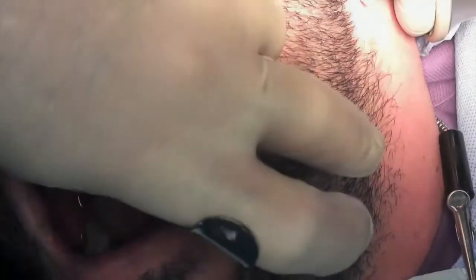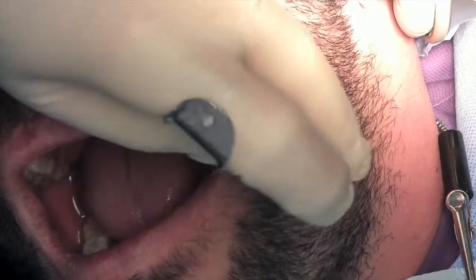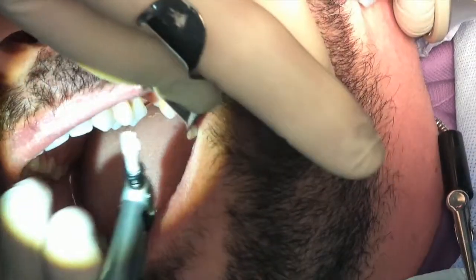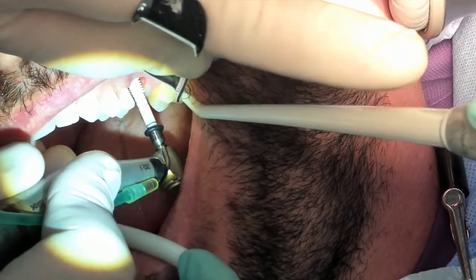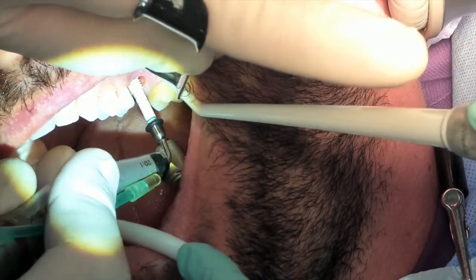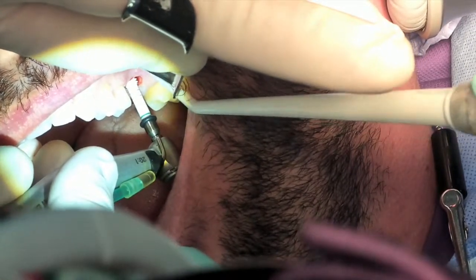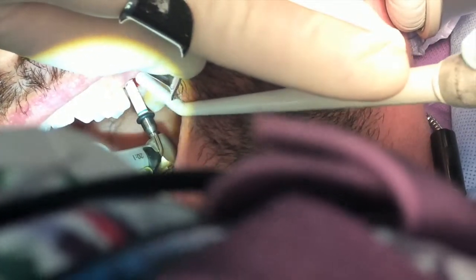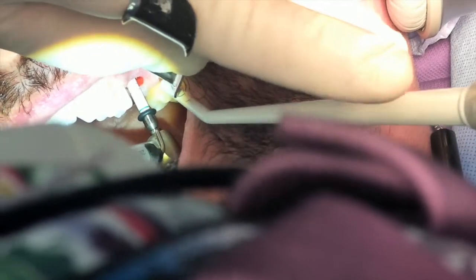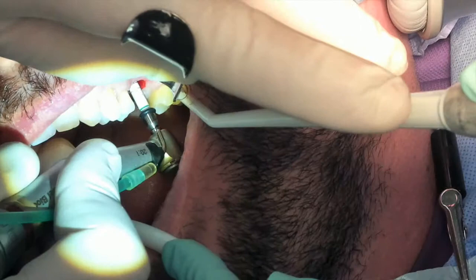I've pushed the bone up to 2 millimeters in the septum. But we are going to tap. So we're going to just come in here with our 5.0 self-tap. Ceramic drills are phenomenal. They stay case after case after case. So beautiful, so sharp, such a good cutting surface. And we're just going down to the 10 millimeter line. Right there, perfect.